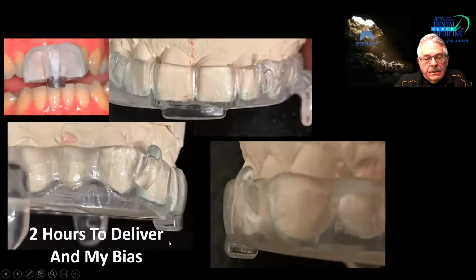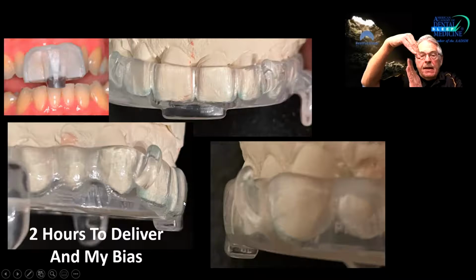I didn't get a chance to look at the lower component to this. But if that lower platform is not wide enough anterior posteriorly, which it might be, you will have the risk of that patient protruding the mandible on their own, not during titration, and then falling off the front of the bump. So you don't want that to happen. You don't want the patient to be able to do that, okay?